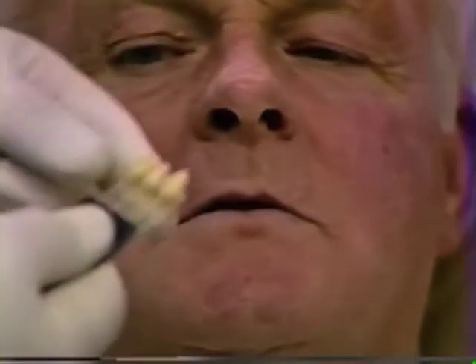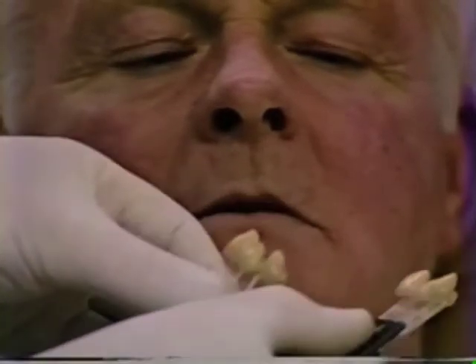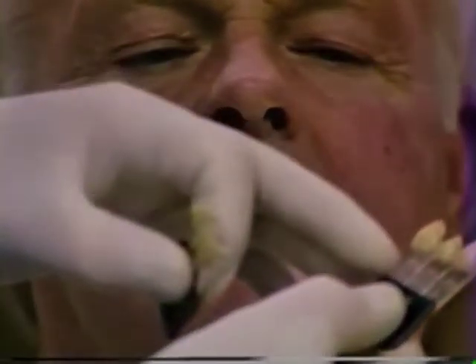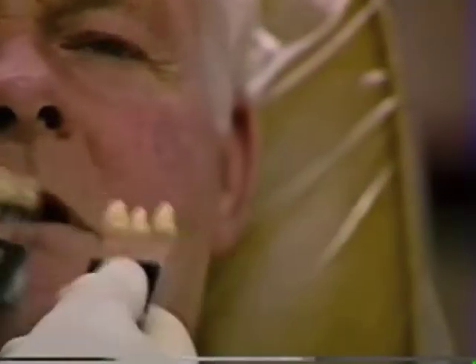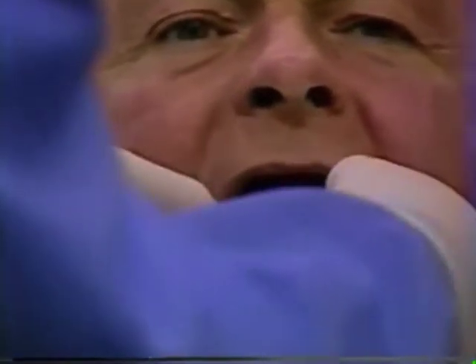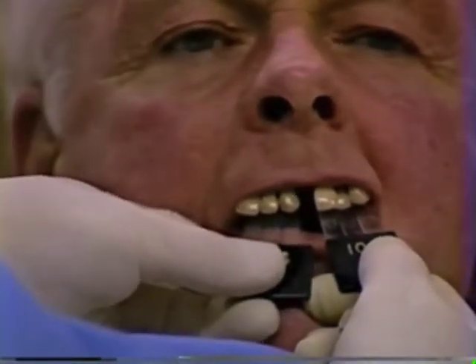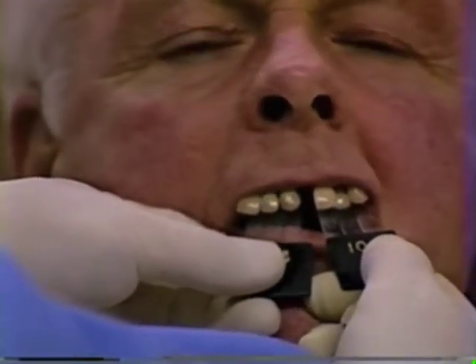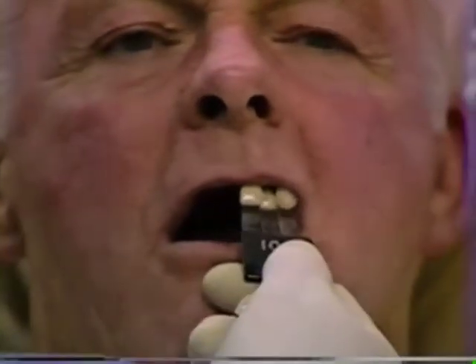Shade 106 is the one we chose from those two — it has some gray in it and also some yellow, but more gray than 114. The other one we'll try against it is 113, which has a lot of gray. Looking at both, 113 has far too much gray — it looks like an old tobacco chewer. The 106 looks much better than 113, so we get rid of 113.